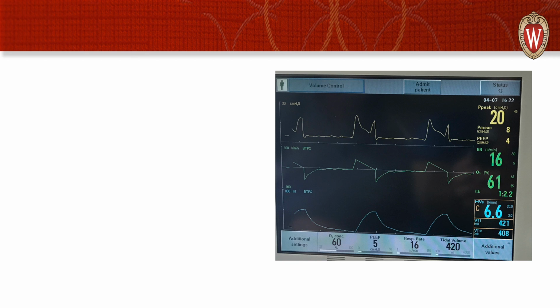Very nice for air-hungry patients because it delivers a high peak airflow rate right at the start of the breath. The problem being that this patient wants more flow than that, and the flow is fixed. The vent isn't giving more air. The vent gave that set amount of air, and the patient is trying to suck in air, so when the breath starts, they get this little peak in the airway pressure. But then the patient tries to suck in air so hard, with so much negative diaphragmatic pressure to try to get a bigger tidal volume, that it's pulling the pressure waveform negative.